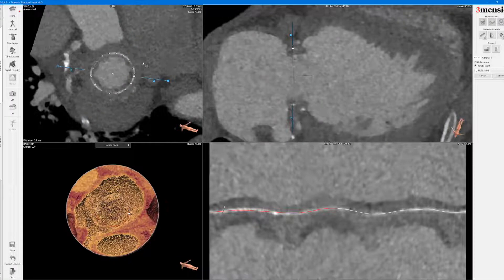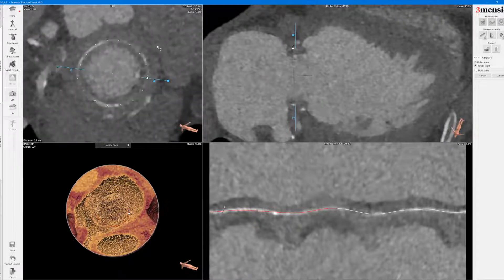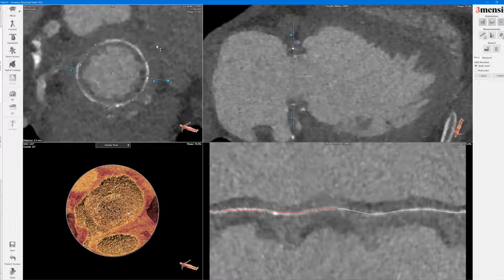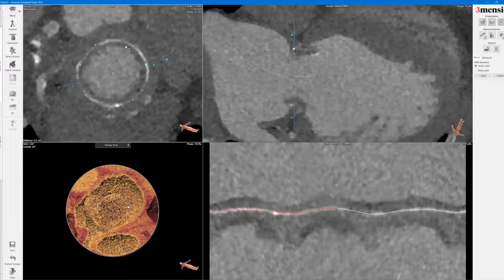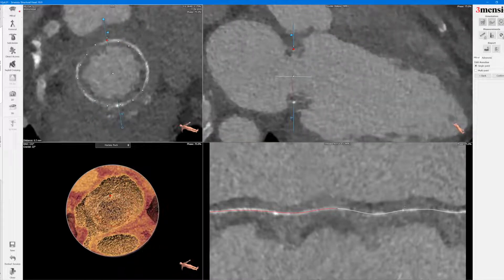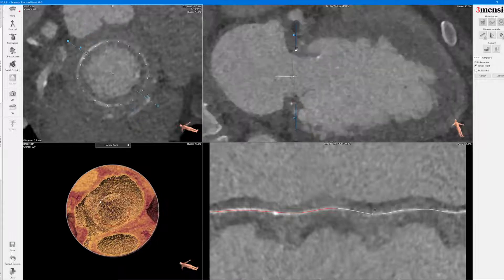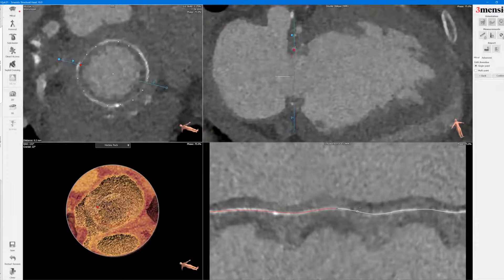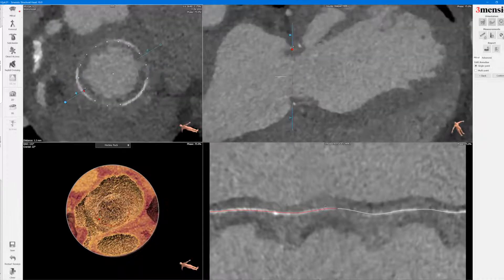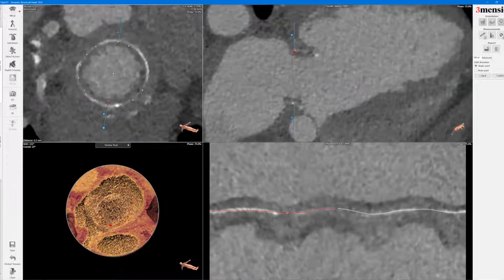And you can see here — this is important — this is the axial view of the surgical valve. What you want to see is that you're at the inner part of the frame. You don't want to overestimate the measurement, so this is where you go on this particular plane to be able to see that you're actually in the inner frame so you size appropriately.